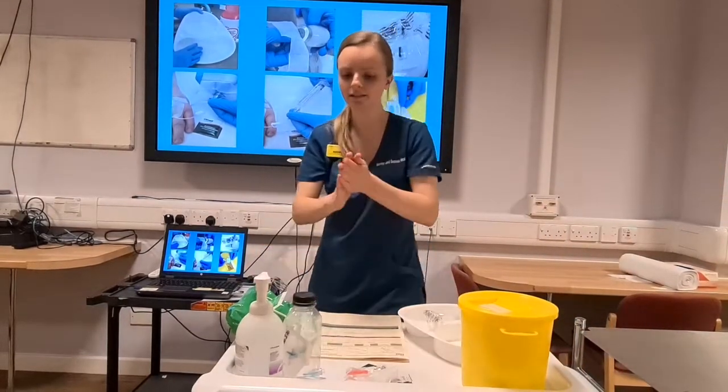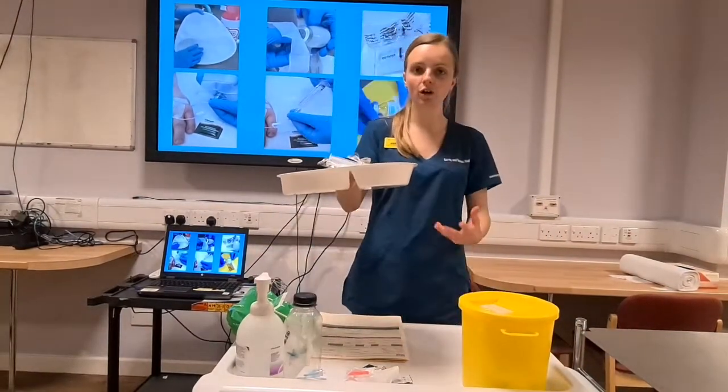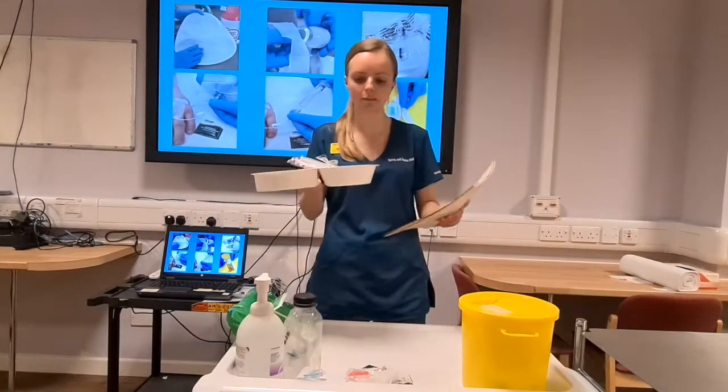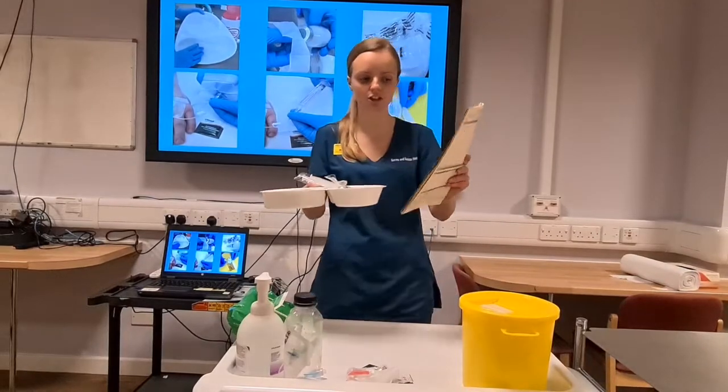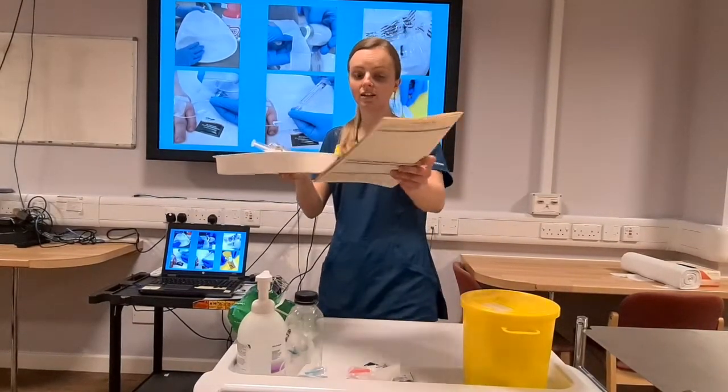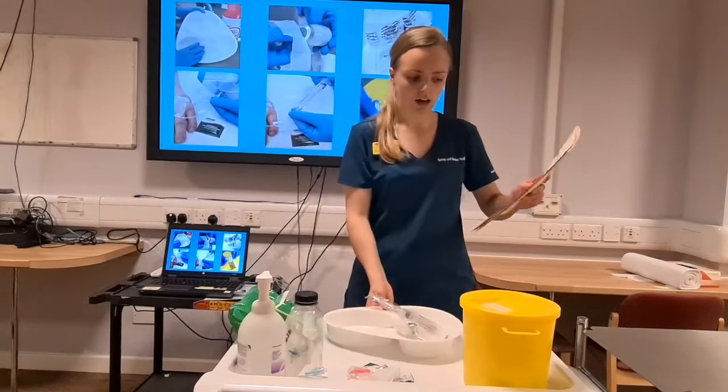Decontaminate my hands. I'm going to go to my colleague, another member of staff who is IV trained, making sure I'm holding on to my medication and my drug chart, and I'm going to make sure that they are definitely going to check it, not just sign blindly.